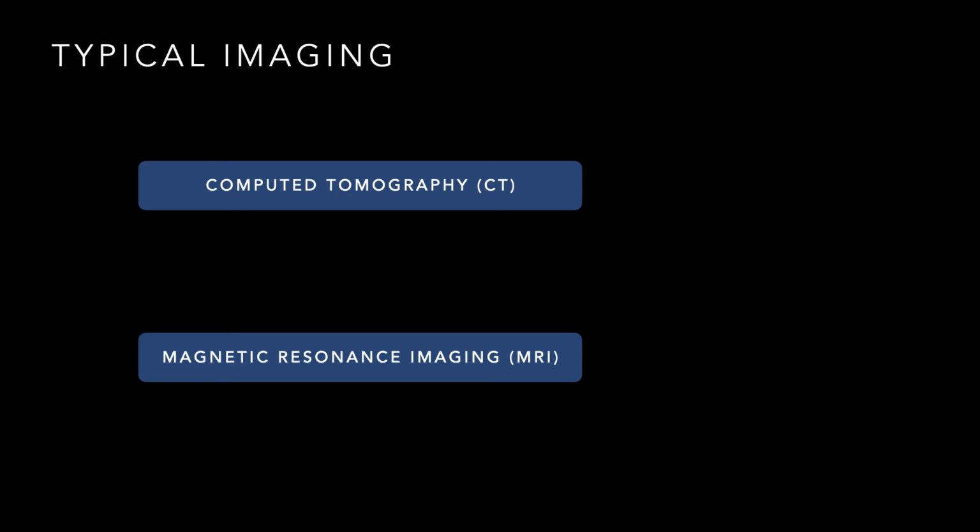And so the typical scenario is probably going to be something to the effect of, I have this patient who has this thoracoabdominal injury, pelvic injury, and I CT'd them to look for injuries, and I found it on CT. So it may be an incidental finding. Or if you have this large thing and ultrasound's not available to you, or you could get your consultant on board and they ask for it, you may be CTing through this lesion to get more of a global, holistic perspective of what's going on with this lesion, right? Ultrasound's great, and we're going to advocate for it strongly as an initial, maybe potential screening modality. But what it's limited to is its field of view, right? And so if you don't have a broad field of view, you're only going to be able to see what's narrowly under that probe. And so CT is going to be able to rectify that problem and basically show you the whole thing at once. And so CT is probably going to be your front end test.